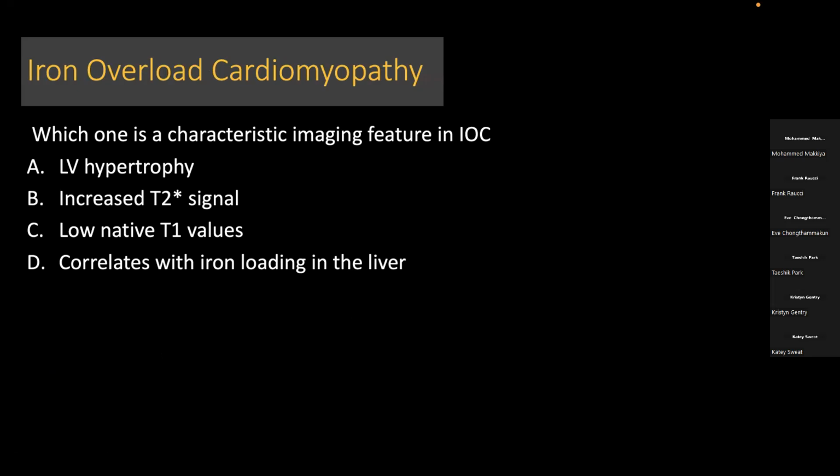Low native T1 values. So it's the opposite of increased T2 star signal. Yes, T2 star signal is used, but it's low. It should be low, not increased, but the low native T1 values is the correct answer.